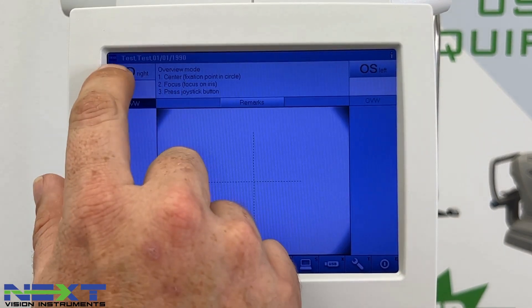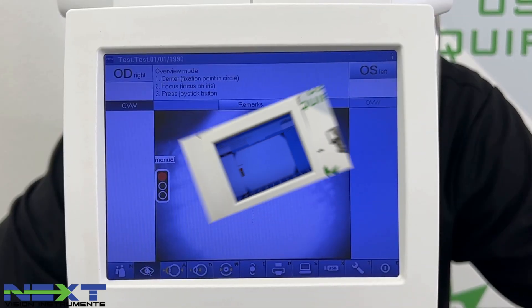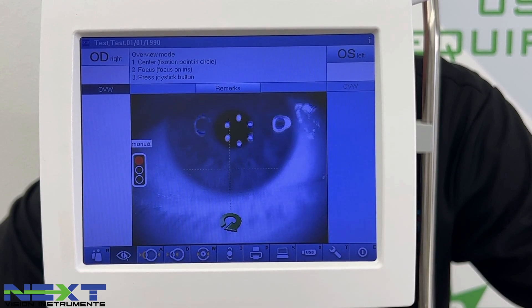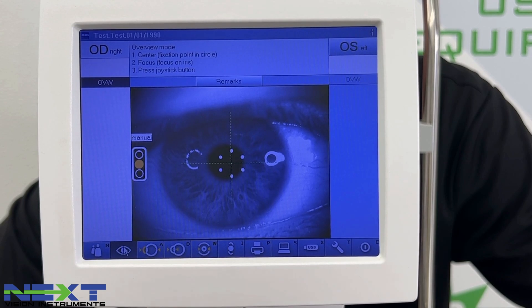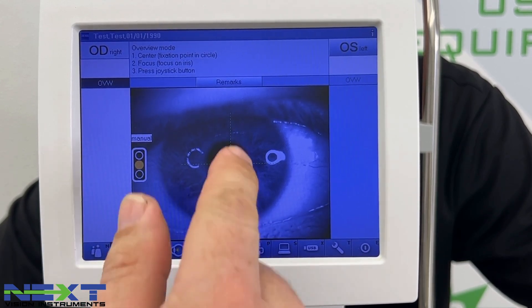Once you have everything entered, click the Next icon. The patient information you just entered will confirm which patient you're on. This is Overview Mode — the initial screen where you'll line the patient up for measuring.